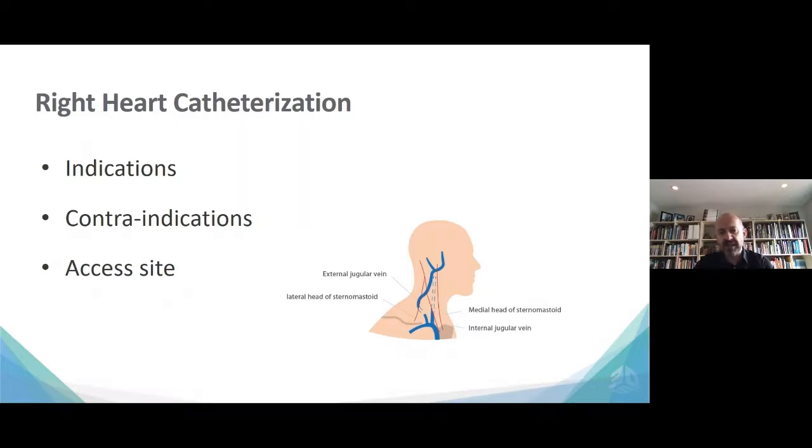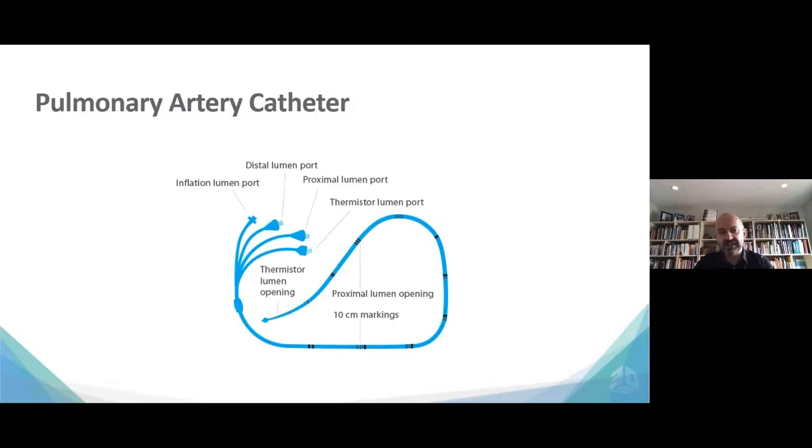variations. So on the next slide, what you'll see is your typical PA catheter. There are some tips and tricks that are really good to look at. Here are these black markings on the catheter. When you're at bedside, you do need to know your distance from the tip of the catheter. And it's pretty much standard.